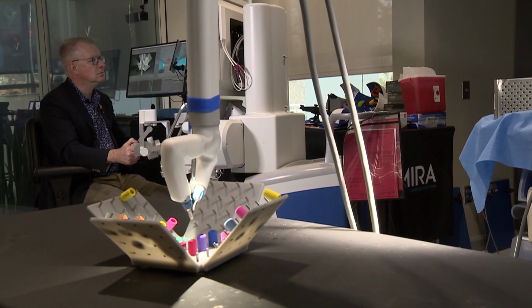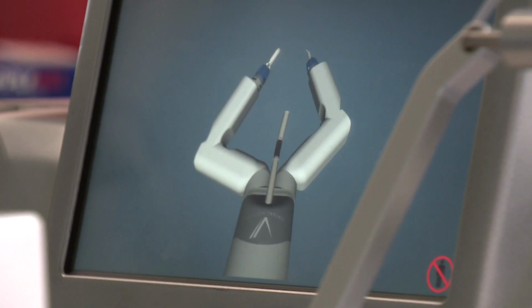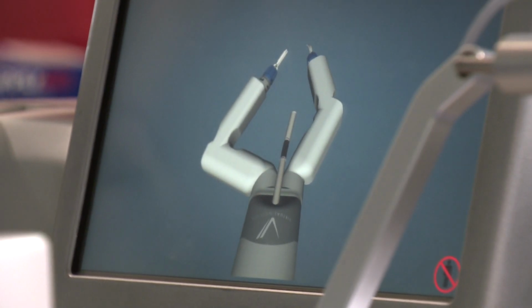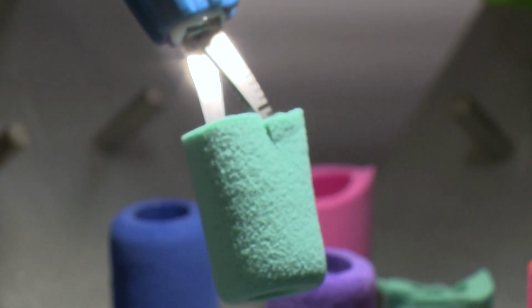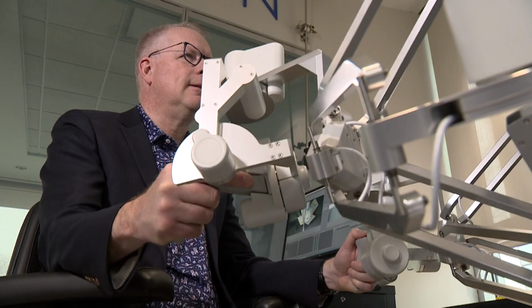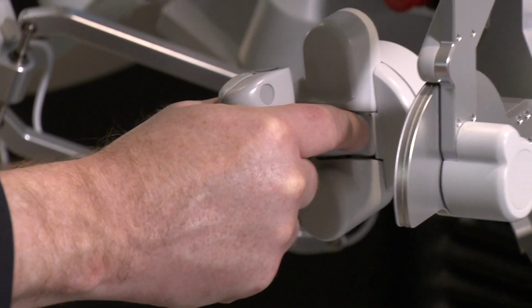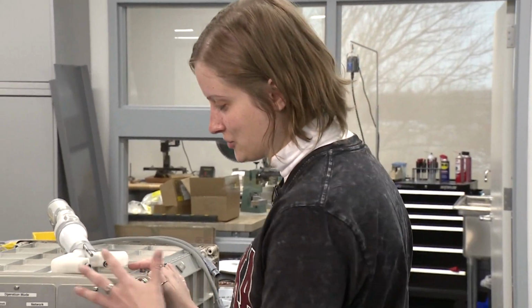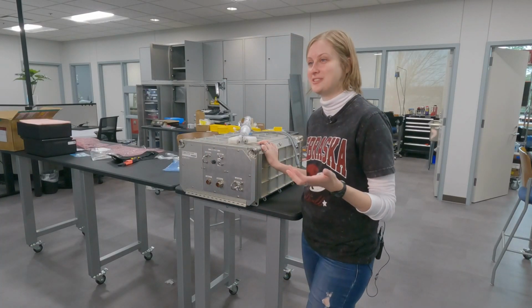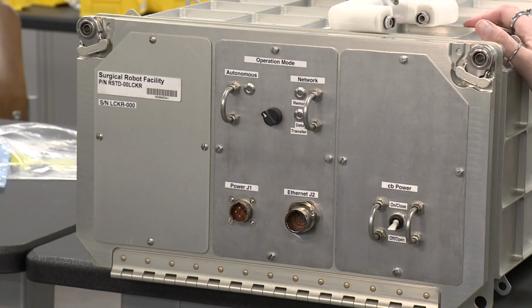This surgical robot is built to remove sections of colon. Because the incision is so small, the patient can recover in days, rather than months with typical open surgery. While the operator is in the same room with the robot in the simulation, they could be in different hemispheres. So you'll see we've designed a control panel. Rachel Wagner is a UNL PhD student. This box and what's in it is her thesis.